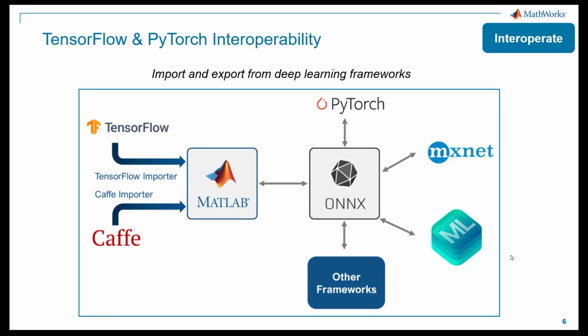Bring in models from PyTorch, Caffe, TensorFlow, through ONNX, the Open Neural Network Exchange. Just keep in mind that you can interoperate MATLAB with other environments and can call MATLAB from those environments, and those environments from MATLAB. So this gives you nice options for working with our tools.